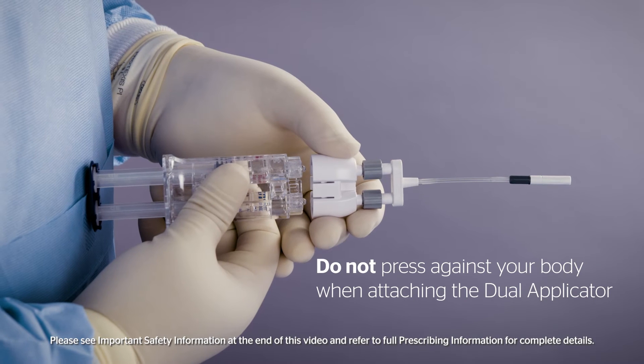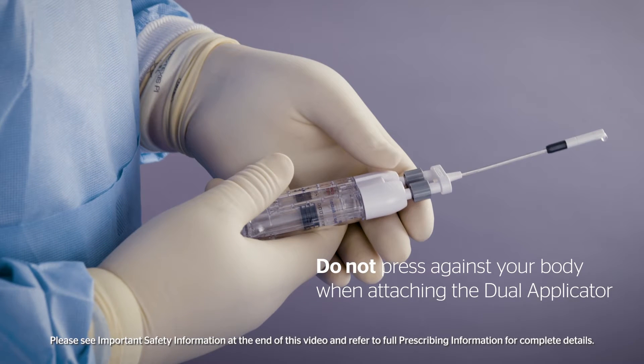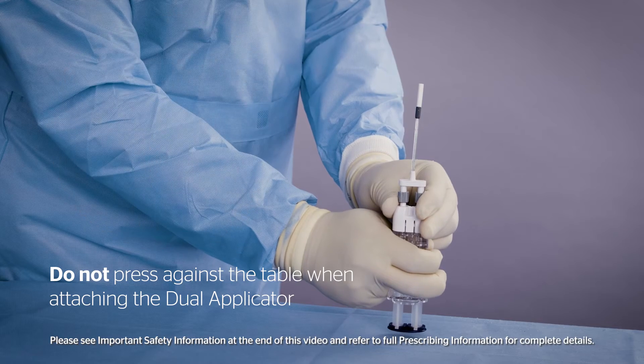Do not press the plunger against your body when attaching the dual applicator. It is critical that the OR team does not depress the plunger until its intended use. Do not press the plunger against the table when attaching the dual applicator.